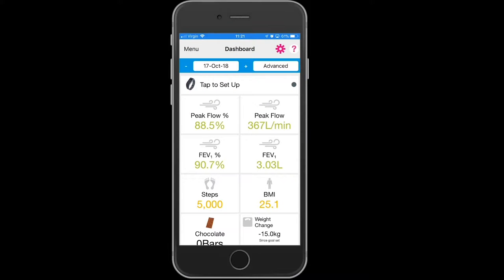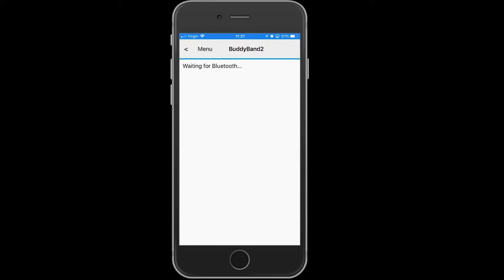To pair your BuddyBand2 to the Activ8rlives Health+Wellness app, you will need to ensure that your smart device has Bluetooth turned on and is connected to the internet. Touch the image of the BuddyBand2 and tap to set up.